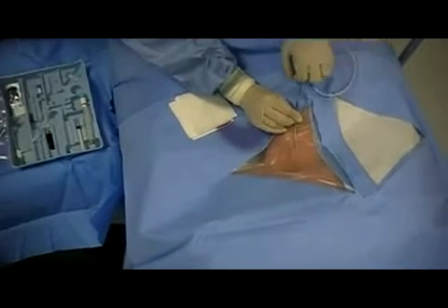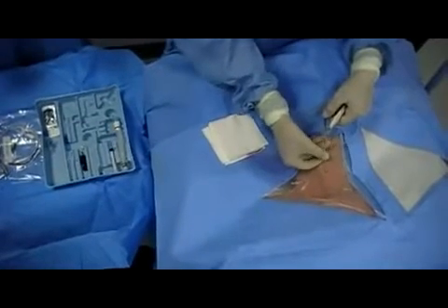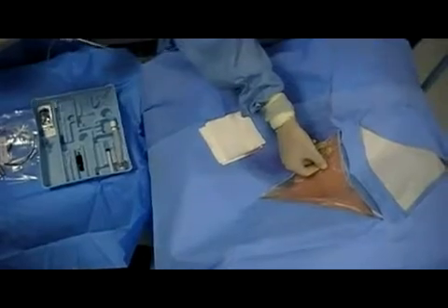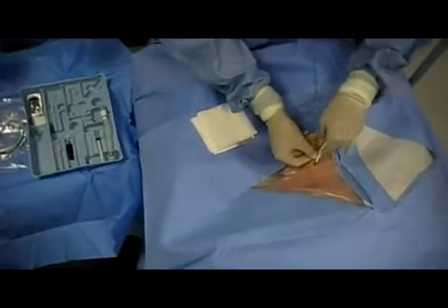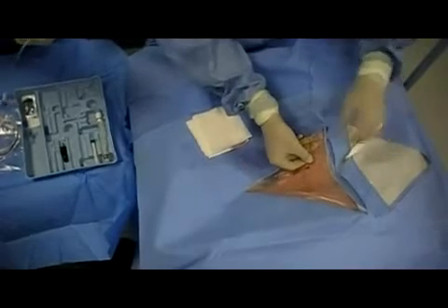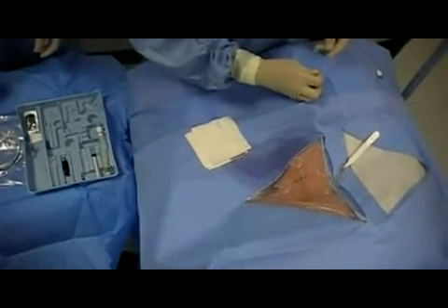Here we have access to the right internal jugular vein. With one hand holding steady the needle, the wire is advanced into the vein. The needle is then removed and a typical cut is performed next to the wire with the scalpel. The entire cordis sheath with the dilator in place is inserted over the wire.